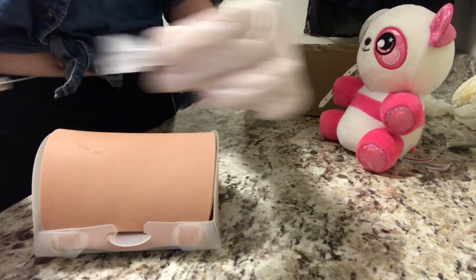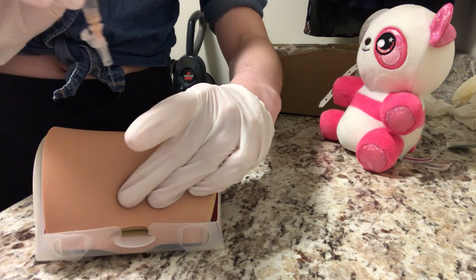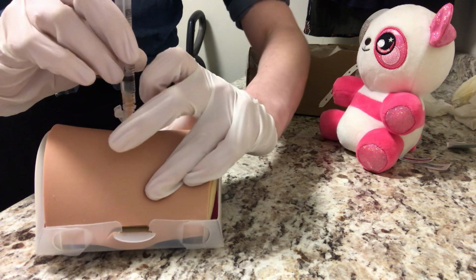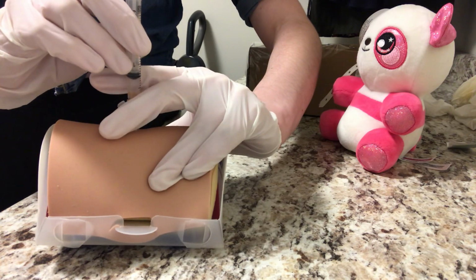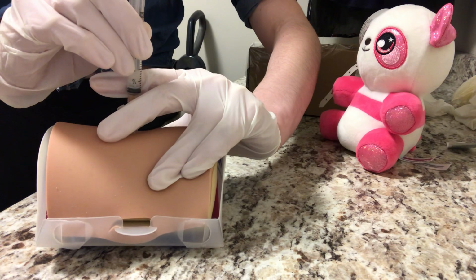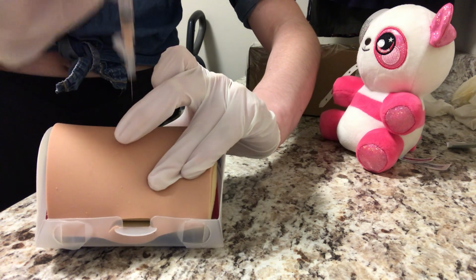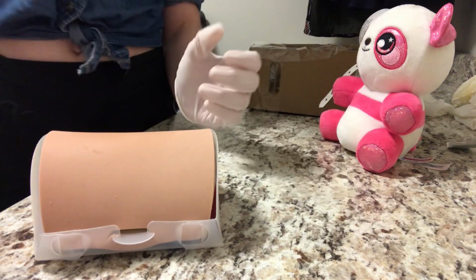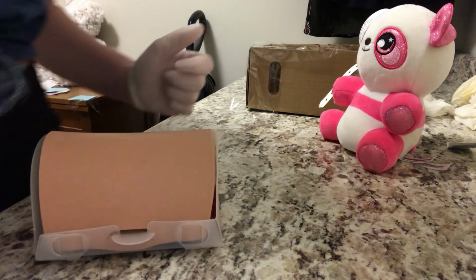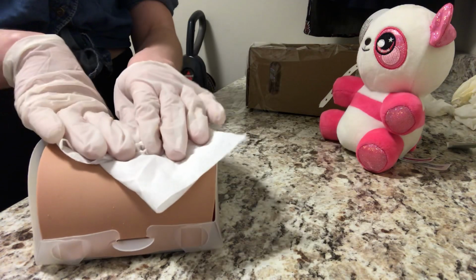So I'm going to safely uncap. I'm going to pinch the area. I'm going to go in like a dart. I'm going to stabilize without letting go of my pinch. I'm going to inject. And now I'm going to wait a few seconds. I'm going to remove my stabilization, remove the needle, remove the pinch, and I'm going to activate my safety and throw it in the sharps. And then I give my patient a cotton swab to press against the area.